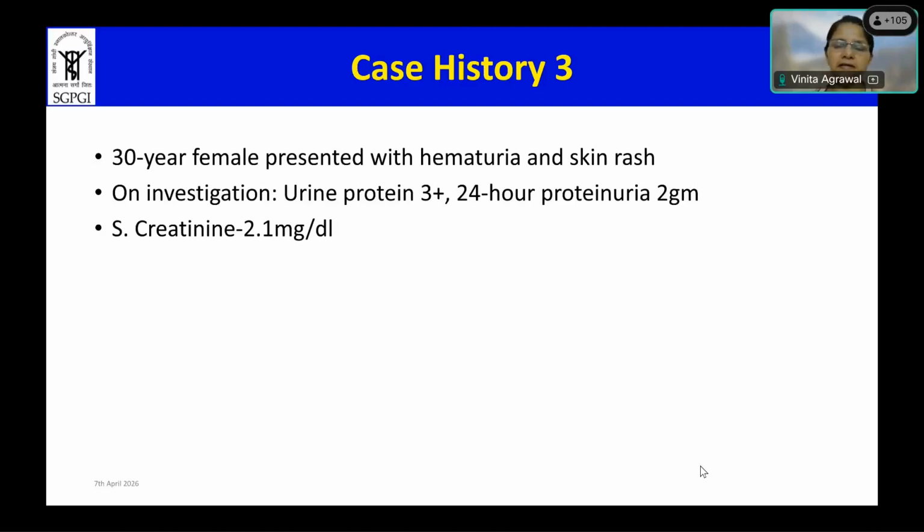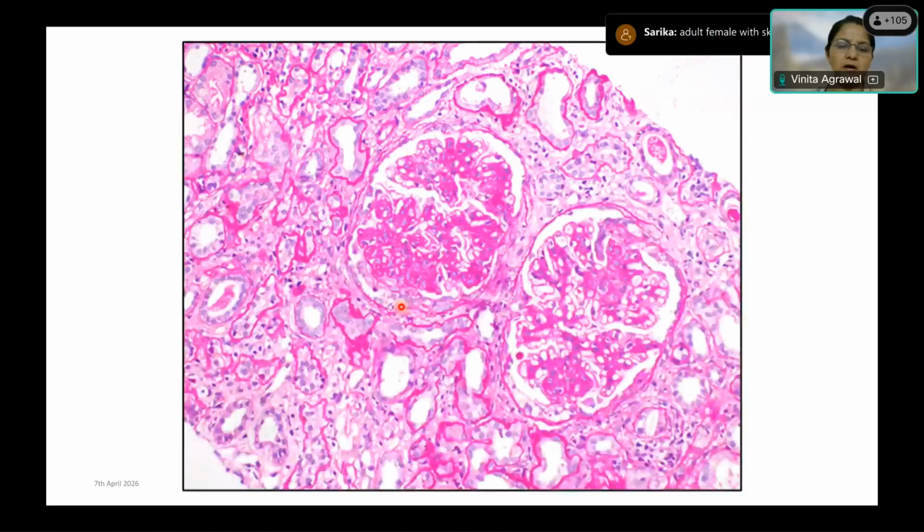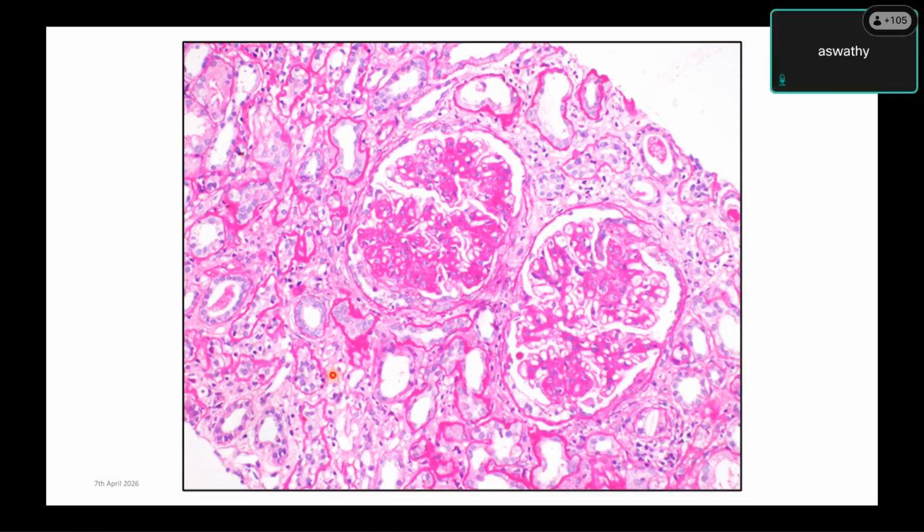Okay. Now let us look at the biopsy. Yes, ma'am. So what do you think is the stain, and what are we looking at in the renal biopsy? Tell me about all the compartments that you are seeing in this biopsy field. The glomerular, how many glomeruli? Stain, H&E, ma'am. This is not an H&E. Do you look at the basement membrane? Sorry, ma'am. It's a PAS stain, ma'am.